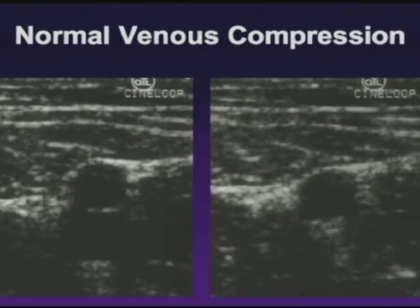There is one process by which people who record images for non-compressible and compressible sometimes leave a little bit of vein so that you can see where the vein was on the compression images. I don't feel that's a very good idea because it's difficult to separate a partially compressible vein from a completely compressible vein with this. So I like pictures where I can't see the vein completely, where I understand that the vein has disappeared because it's completely coapted.